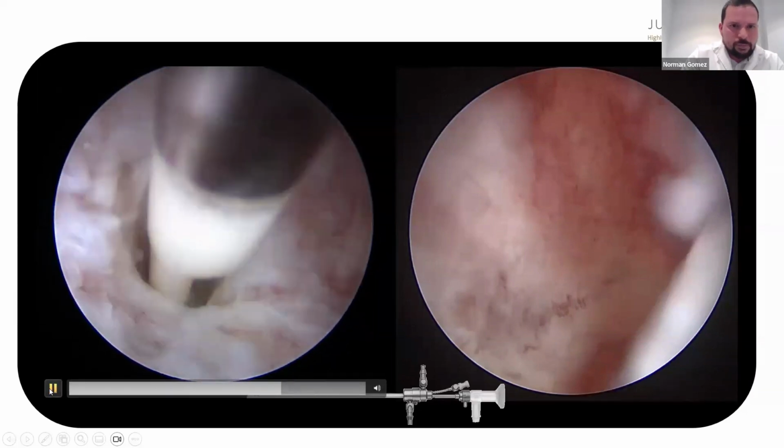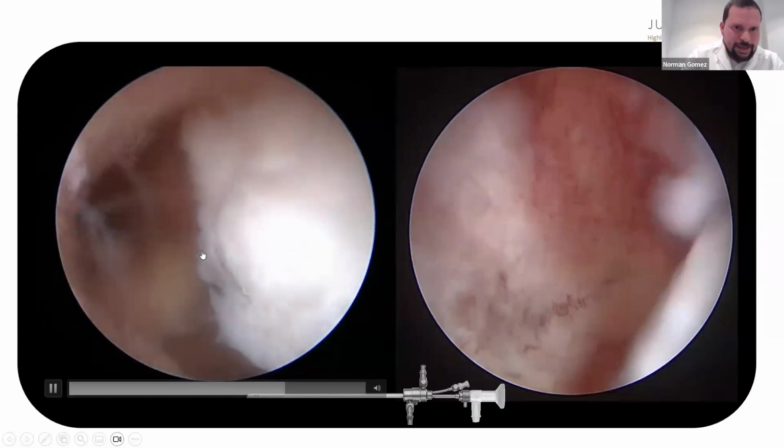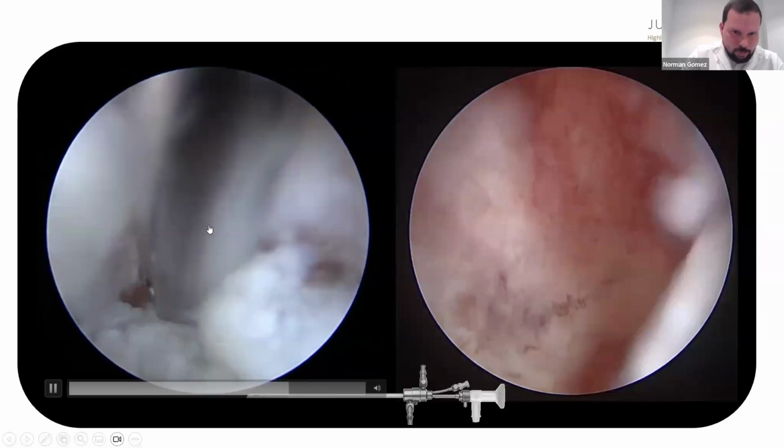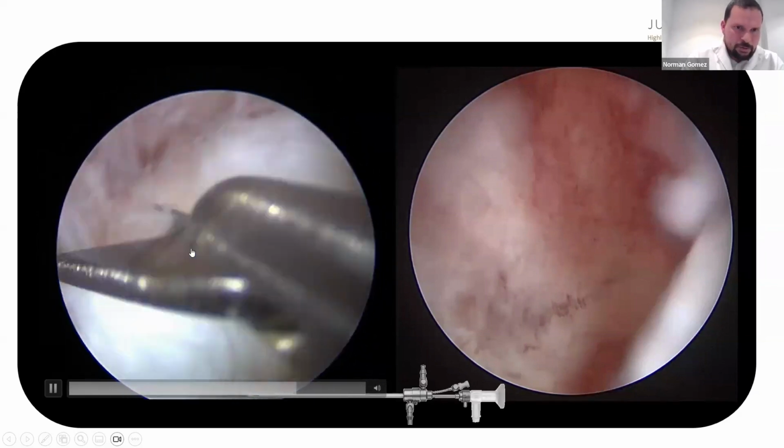As you can see, this more white area and almost round area here is another fibroid behind the first one. So you can identify it with the colors of the tissue, because you can see this uniform white structure there. And also you can compare with the subendometrial line, all the trabecular tissue surrounding the fibroid. So you can look at the aspect of this tissue, we can see very well all the fibroids.